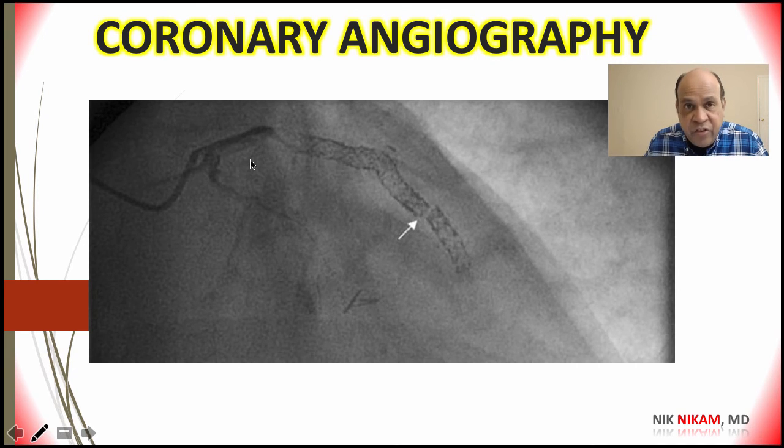This is a very serious situation. Here we have the left main coronary artery, and here is a stent, and there is practically no blood flow through the stent.